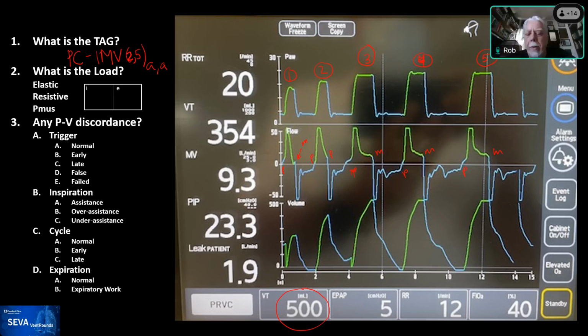Yeah, there's a couple of comments. One, for IMV type 5, we disregard the TI max setting because, as you said, Ariel, that is in the case of, let's say, a massive leak or non-invasive ventilation, and pressure support just doesn't work. But if the patient makes a very small inspiratory effort, like his neural inspiratory time is 0.2 seconds, then the ventilator says, no, you can't shut off the breath that quickly. It has to be at least 0.6 seconds in this case. So it's time cycled, it's a mandatory breath.